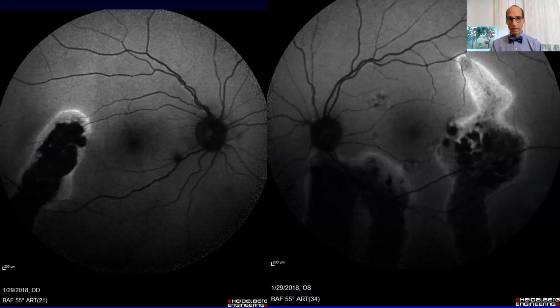We look at a lot of autofluorescence images. This is a patient with chronic central serous retinopathy who came in. The retina looked very close to normal, and the patient was totally asymptomatic, but when you look at the autofluorescence, there are these big gutter areas where there are dead RPE cells here, and these are kind of damaged, and there probably is a little bit of a window defect too. So you get everything in these pictures.